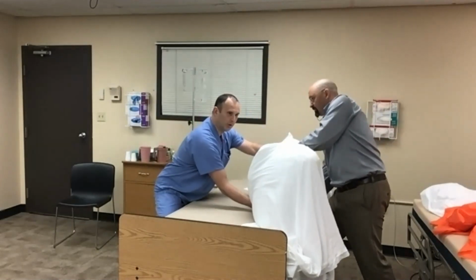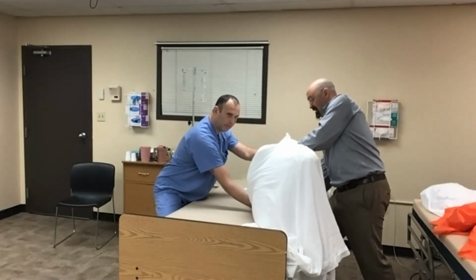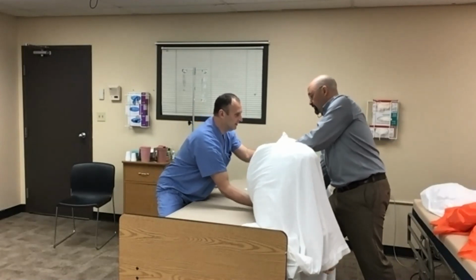So I'm giving a little push. Chris is giving a little pull down low. I'm pulling toward, and he's pushing up top. Especially if you have a larger patient with a large abdomen or thigh mass, the amount of force it takes to get that patient centered supine is substantial. On 3, 1, 2, 3, prone.